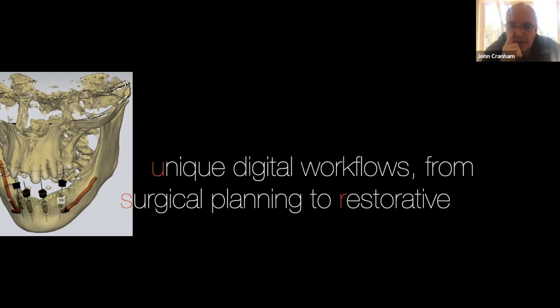Interesting. Don is asking about the CR bite and is Gothic arch tracing best? And I'll just take that one. I do think that with dentures, one of the most difficult things about taking a CR bite in dentures is not manipulating the jaw or any of that stuff. It's keeping the denture bases seated when you're taking the bite.